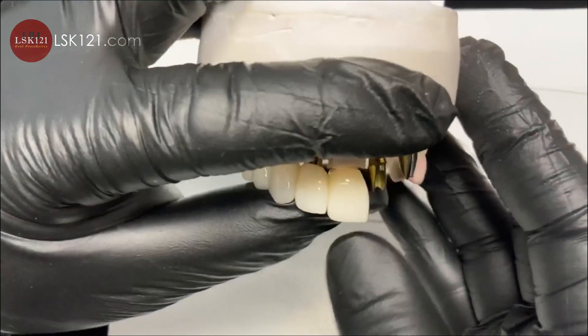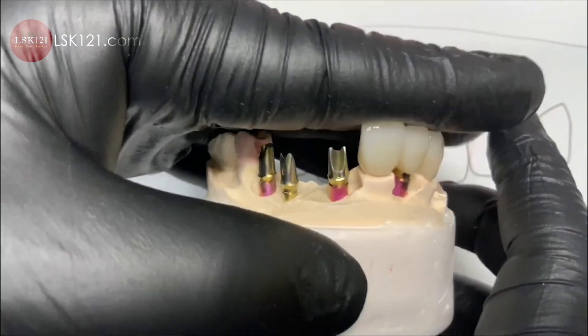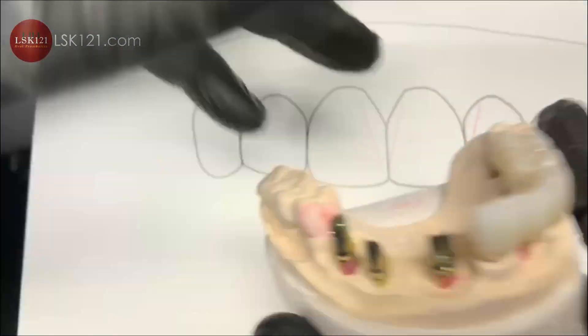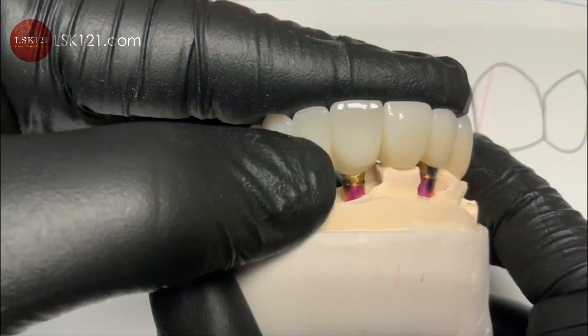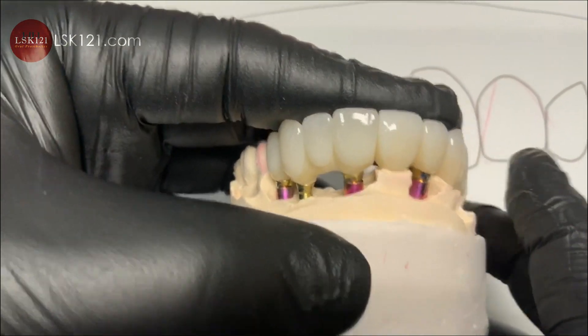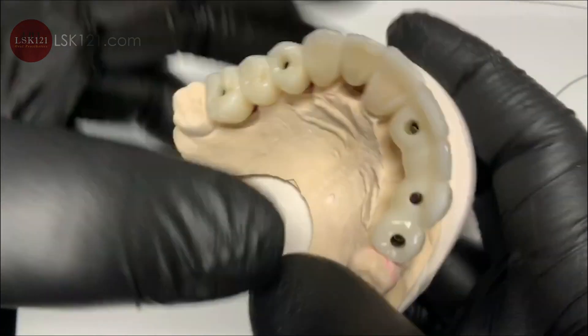It doesn't look exactly like A1, but I see the enamel here — it's high value. We fabricated accordingly, and then we tested it with low value on the other side, which was previously fabricated. You can see a lot of translucency and a little gray compared to the brighter restoration.